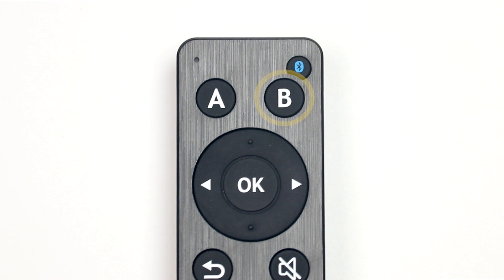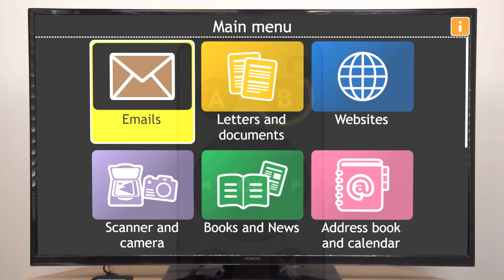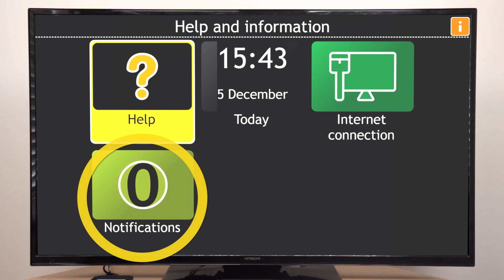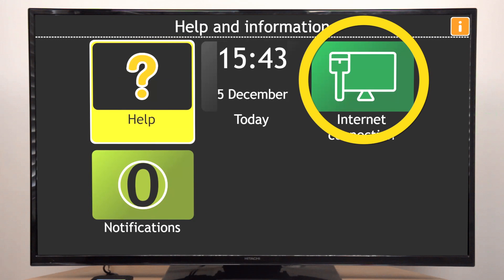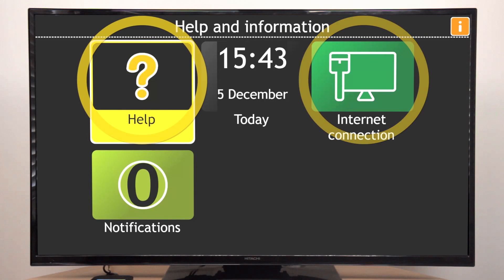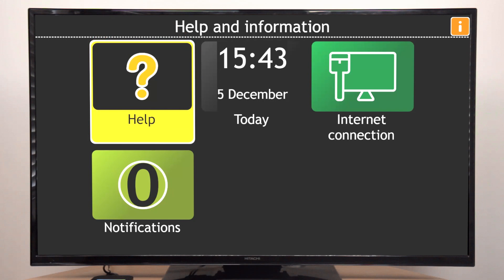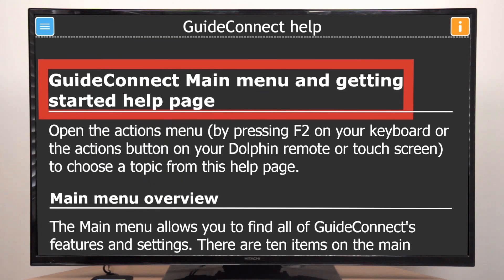The B button, near the top right, is the Help and Information button. Press this button for help and information about your device, such as notifications, whether you are connected to the internet, and more. Select the first item in the menu, which is called Help, to open Help for the feature you are using.